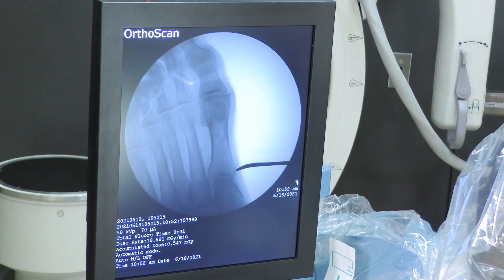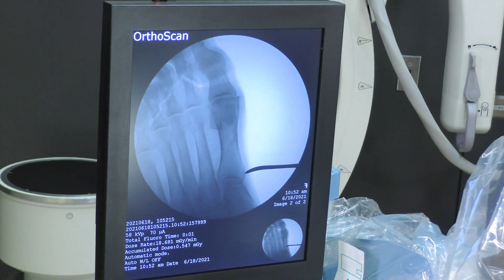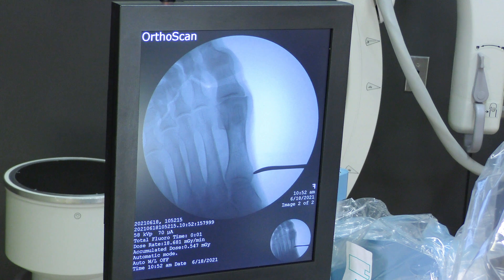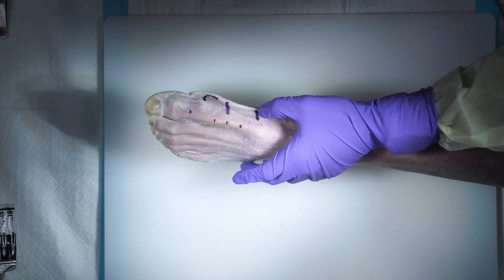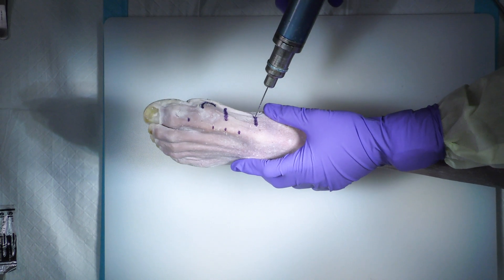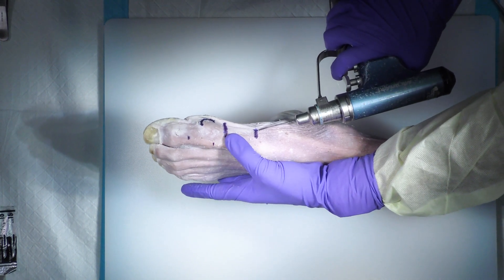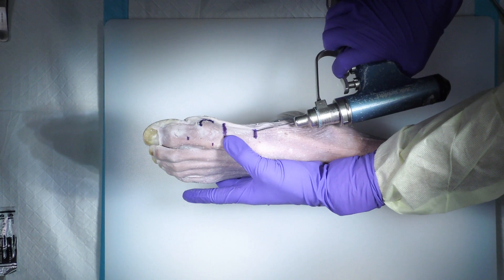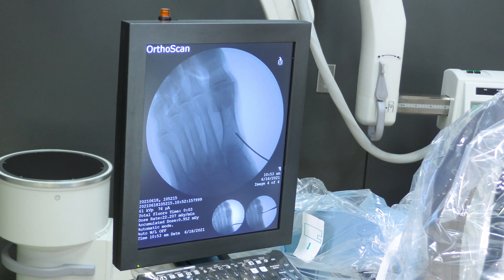The starting point I like to be right at the metatarsal flare, a little bit proximal — that's landmark number one. Landmark number two for me is the osteotomy site; I like to be just proximal to the sesamoid. I like to do the wire placement before I make the osteotomy, so I start the wire into the bone and adjust, feeling the top of the bone to make sure I'm not going too dorsal or too plantar. I check the angle, confirm I like my position, and advance the wire.